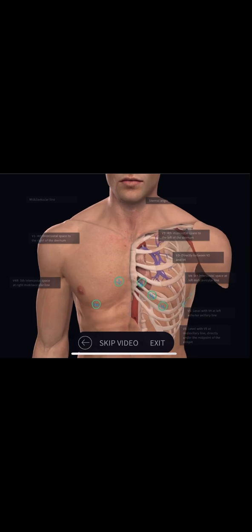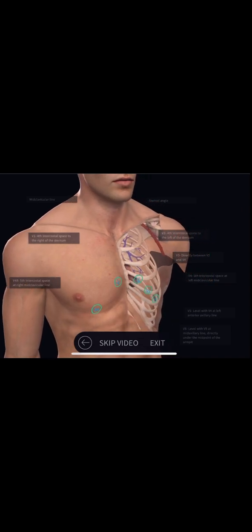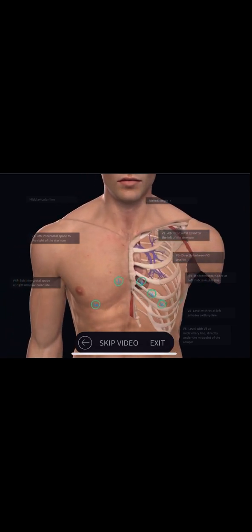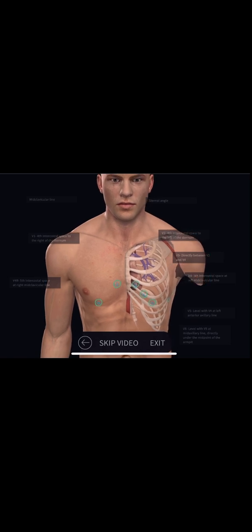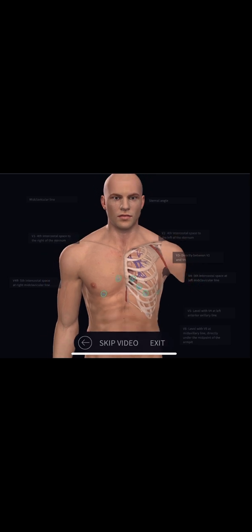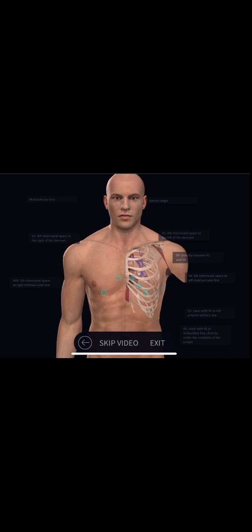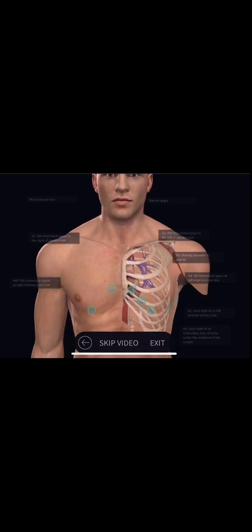Now, the EKG lead will be attached to the electrode and identify the differences in voltage that those pick up or detect. Typically, we discuss this as a 12-lead system, 6 of which will be placed out in our limbs, near the wrists or the shoulders or down in our thigh and ankle, while the others will be placed on our chest, known as chest leads, and these will be numbered according to their placement.